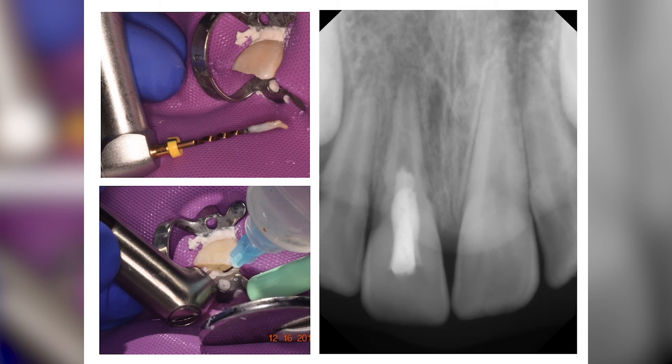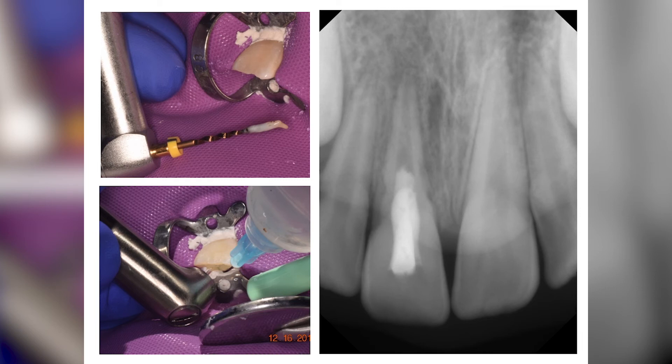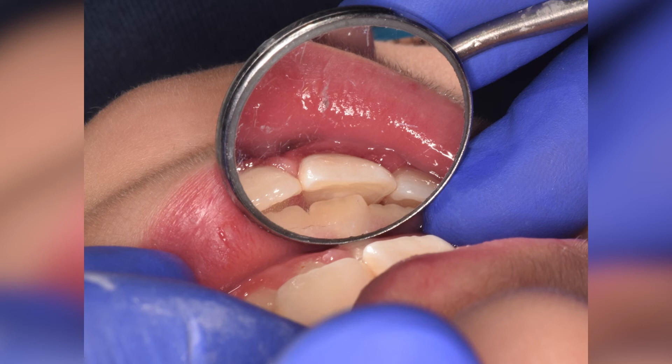Calcium hydroxide powder was placed in the canal, followed by a temporary restoration. The occlusion was checked, which is a critical step in trauma cases — you do not want to have any additional forces on this tooth. Try to reduce any occlusal contacts wherever possible.